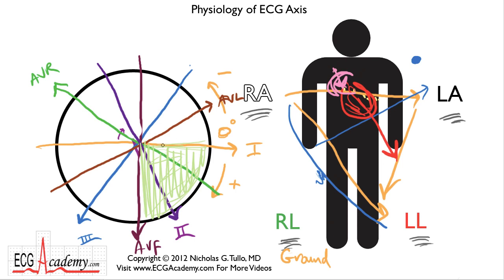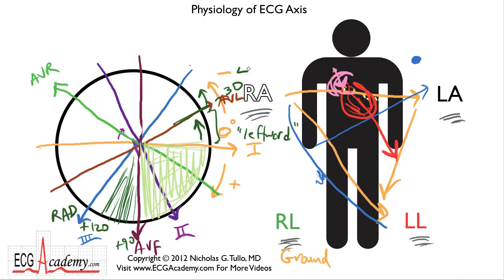If the axis winds up being outside of this quadrant, well, there's a little bit of a margin of error. So if it's in this region here, we'll often call it a leftward axis, but it's not a true left axis deviation unless it's greater than minus 30 degrees. This would be minus 30. On the other hand, if the axis is greater than plus 90, we'll call it a rightward axis until it reaches about plus 120, at which point it really does become a right axis deviation. So you have left axis deviation, which is minus 30 degrees or beyond, and you have right axis deviation, which is plus 120 degrees or higher. Now, how we actually measure axis using the 12-lead ECG is the subject of the next lesson.